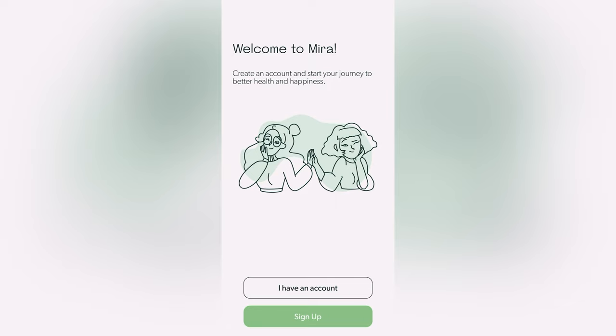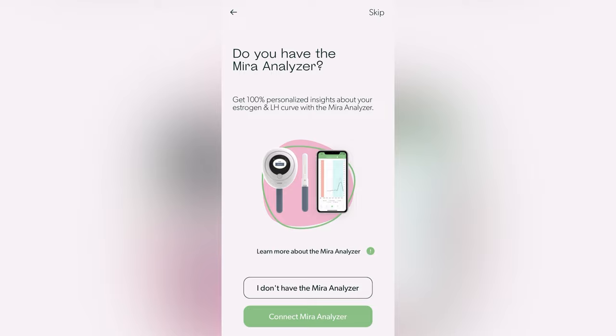When you first open the app, you'll need to create your account. When you get to the next page, this is where you'll scan the QR code on the Mira device to sync your device to your app.